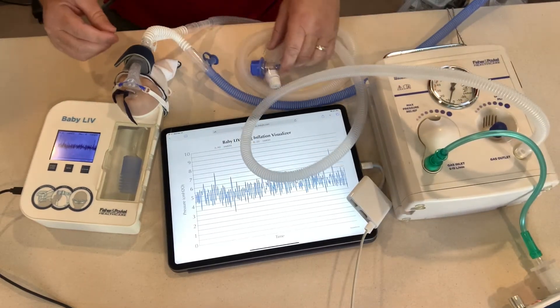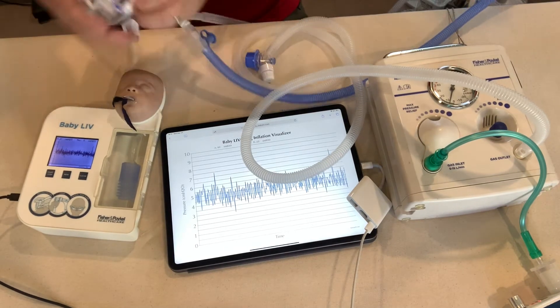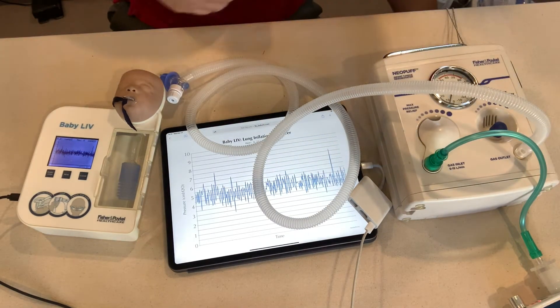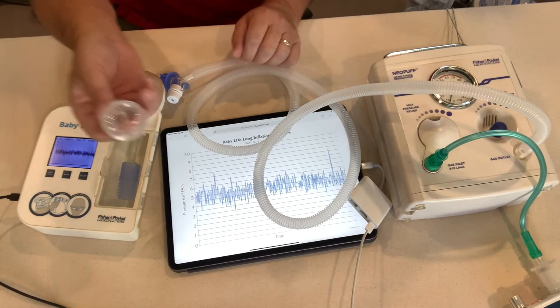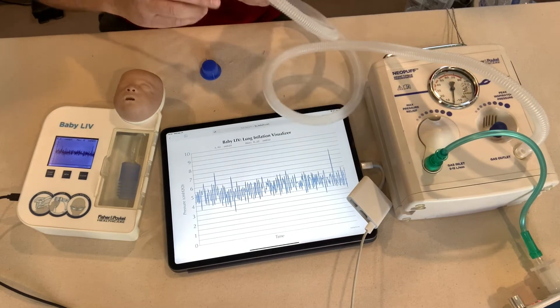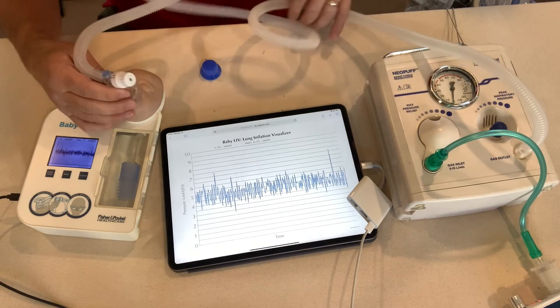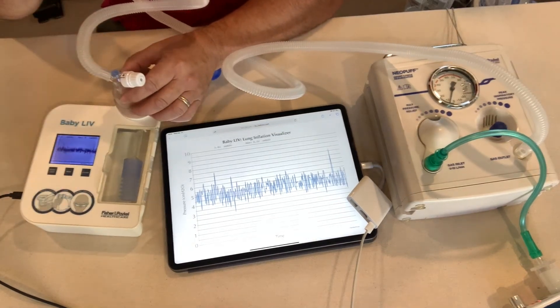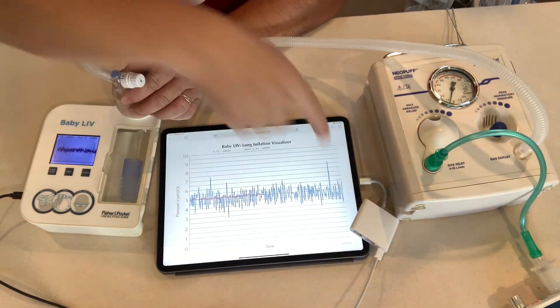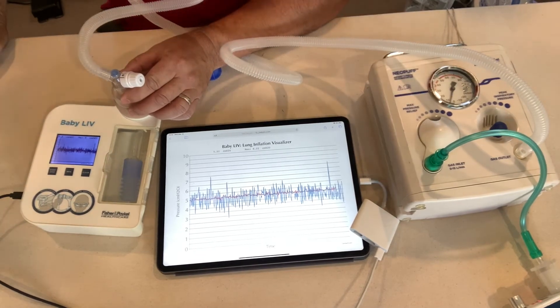So I have a PIP of 20 over 5. Let's go ahead and put that on the baby and see if we can duplicate that on the Baby Live. We'll take off the bubble CPAP interface and take out the pacifier since we're going to be using the mask first. We want to use the mask because we know the mask works with the Neopuff — it's designed to work with it — so we can have a baseline with that.